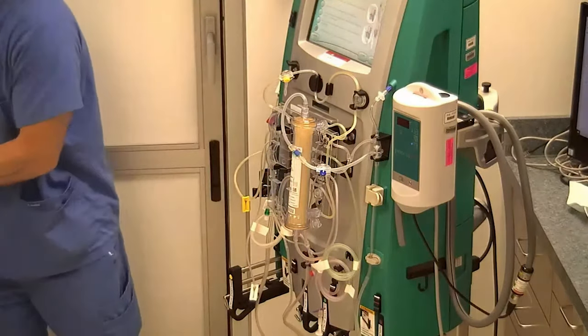So this is where we have another set of pictures. The first one you necessarily don't have to do. It says to route lines through tubing guides. I suggest not to use these tubing guides right now because you want to have as much slack as possible in your lines until you actually connect to the patient. I recommend once you do connect to your patient, then if you would like to utilize your tubing guides, you can put those into these holders. But for now, we're going to skip that step.